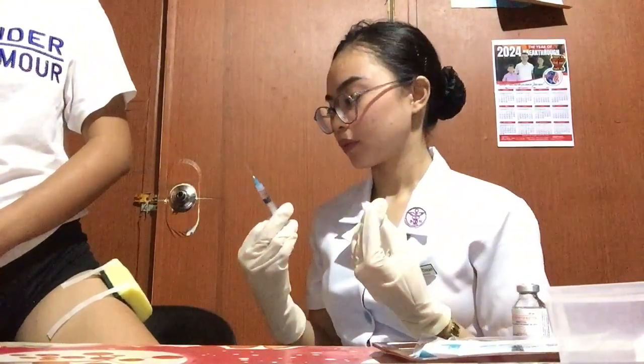If using a prefilled unit dose medication, take caution to avoid dripping medication on the needle prior to injection. If this occurs, wipe the medication off the needle with a sterile swab. Now inject the medication using the Z-track technique.